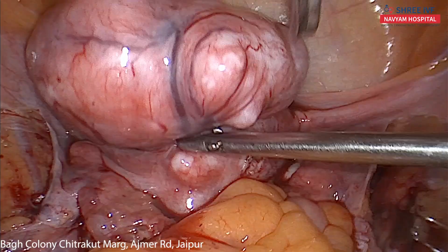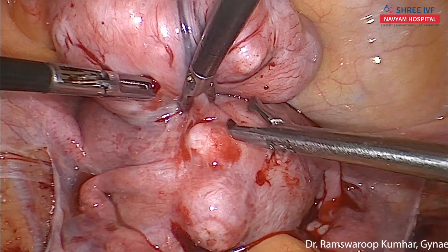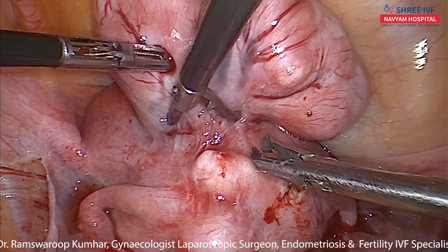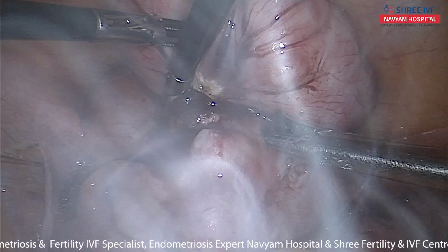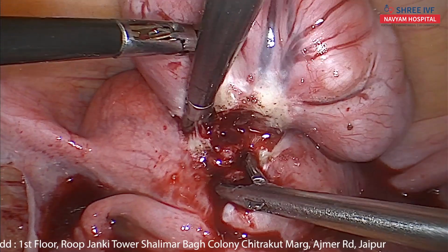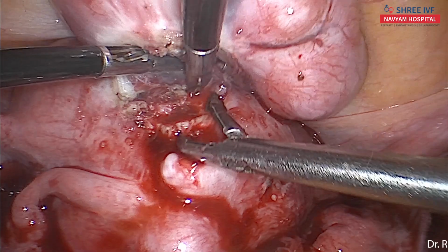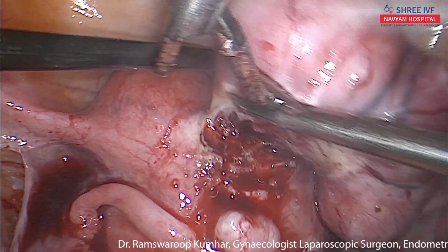Now all these myomas we have to remove. So first, this subserosal large myoma. We will remove it, and the blood loss is purely venous, which is filled in the myomas, and by this method we will avoid blood loss from the systemic side during the surgery.